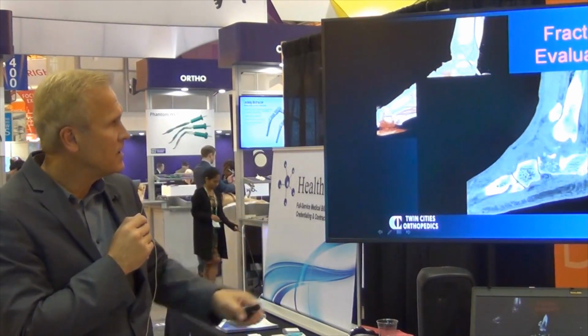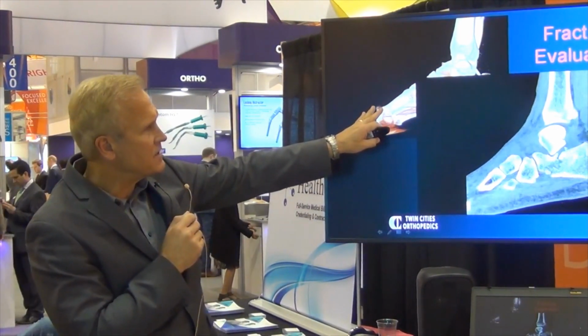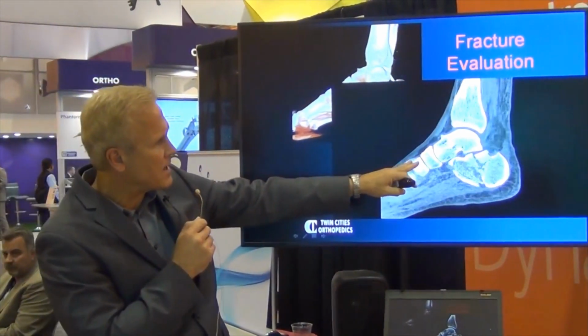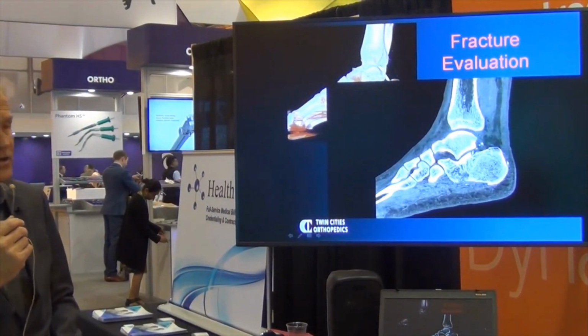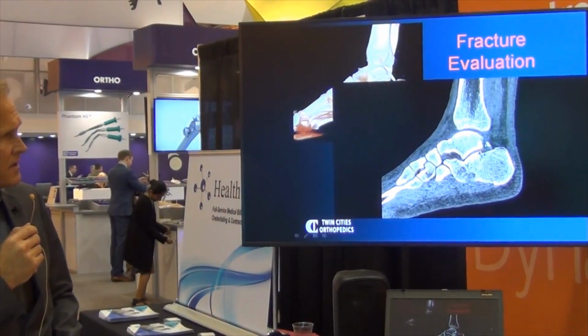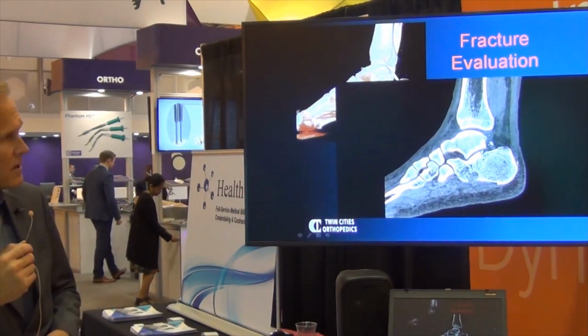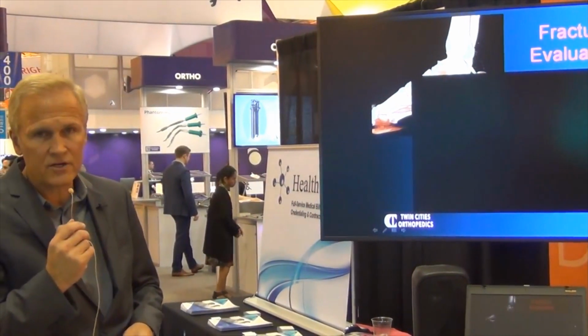So this is a 3D rendering of a CT scan, but then you see the images going through. You can see the detail, every little fragment. You actually see the articular cartilage on top of those fragments as well. And it really helps me decide whether or not this is a primary fusion patient or maybe a primary open reduction internal fixation.